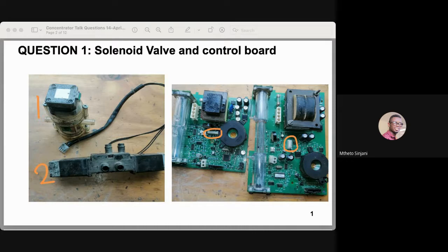The difference between the four-way valve block and the rotary valve is their connection to the circuit board. A rotary valve cannot be used on a board that is designed for the four-way valve, and the four-way valve cannot be connected to the board with the rotary valve connection.